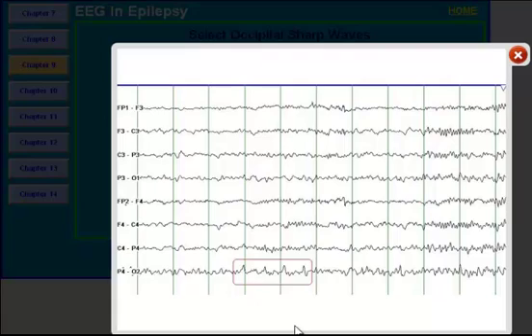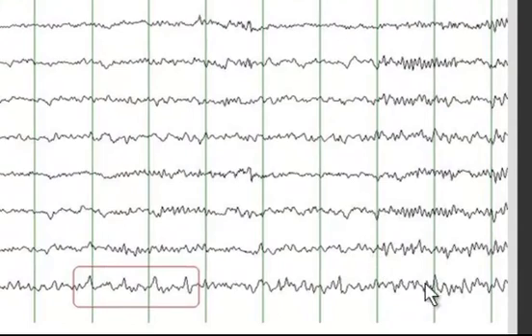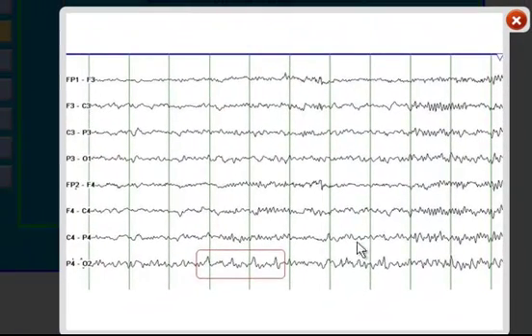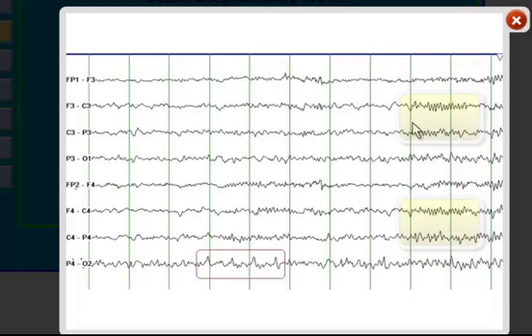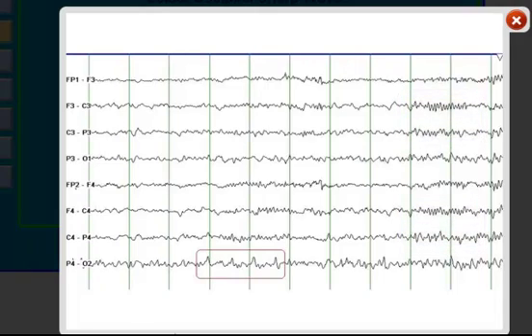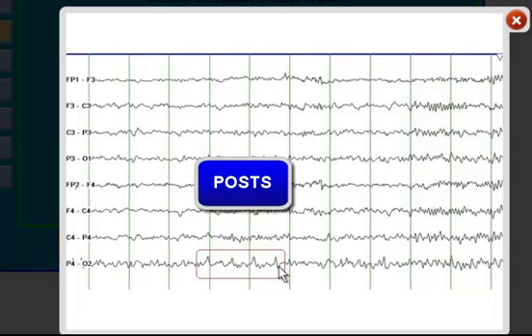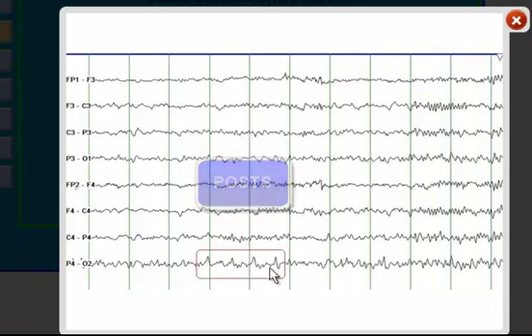So what is the state of this patient? When you look at the EEG the first question you should ask yourself is, is this person awake or asleep? What you see clearly are these high frequency waves in the central head region, frontal central head region. These are sleep spindles. When you see sleep spindles, these are defining features of stage 2 sleep. What you see here, these sharply contoured waves, these are POSTS, positive occipital sharp transients of sleep, which is a benign variant. These are not occipital sharp waves and should not be confused with occipital spikes.